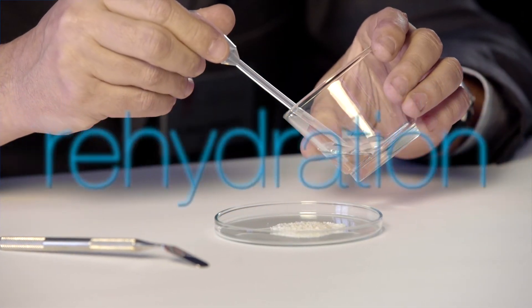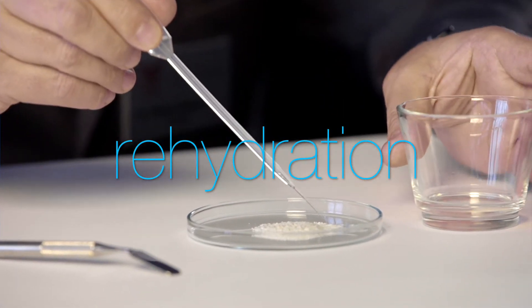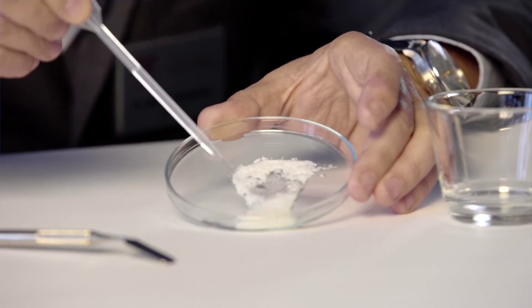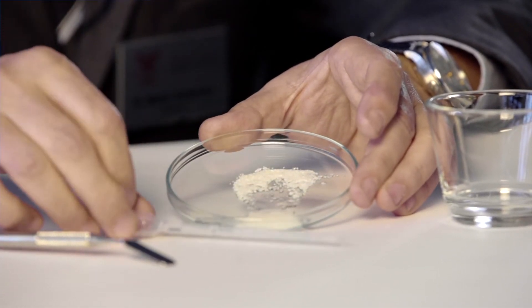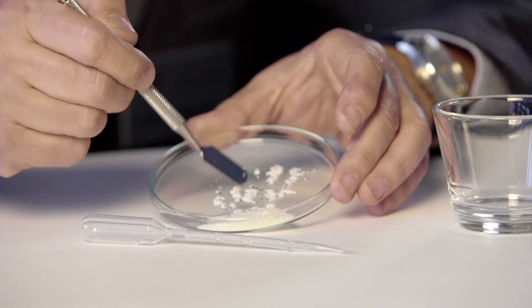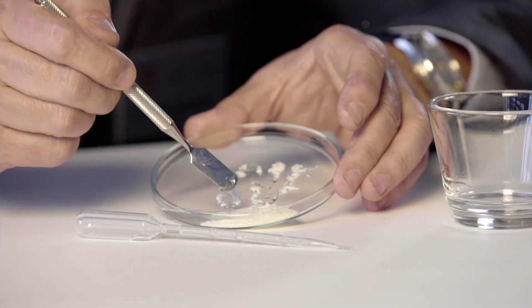What I'm doing right now is trying to get rehydration of this material. Usually I do this before I start surgery, especially when using it in combination with the allograft or by itself — I try to rehydrate the materials before I do the surgery. So we wait 10 to 15 minutes before we apply this material into the receptive site.